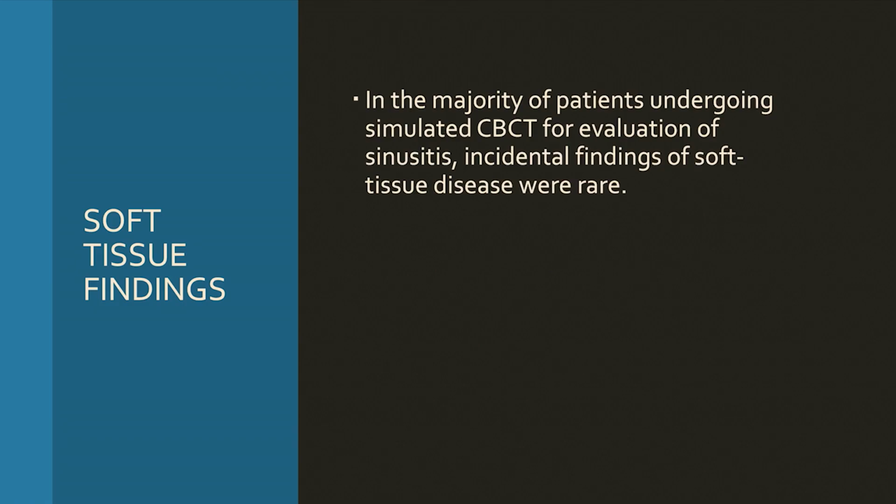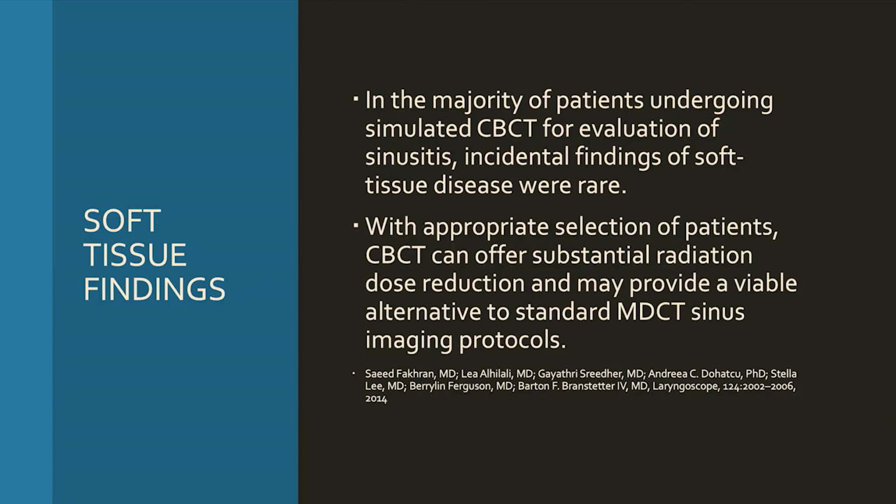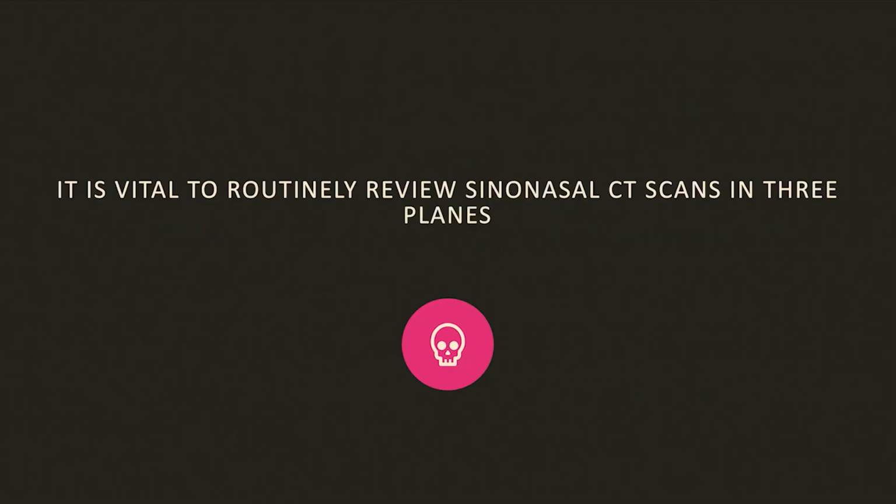There was this idea that cone beam, you were limited because the soft tissue contrast was so poor and you're missing little squamous cell carcinomas throughout the head and neck. The Pittsburgh group came out with a paper here in Laryngoscope. They said the soft tissue stuff wasn't as big of a deal as people made it out to be. You could diagnose most of it on cone beam CT, but okay, so let's get into the heart of it here.